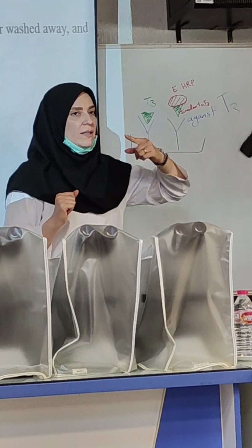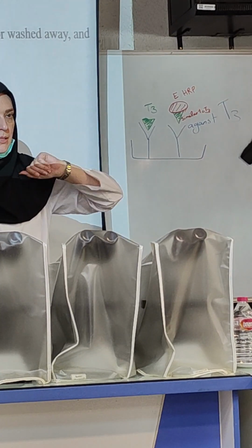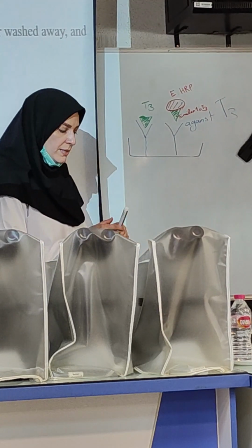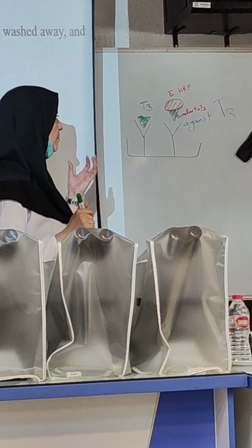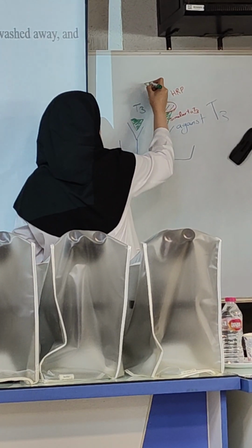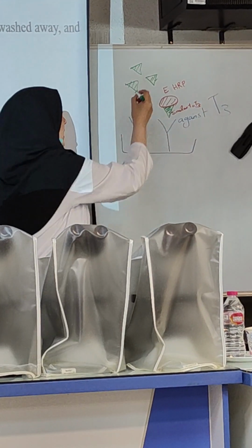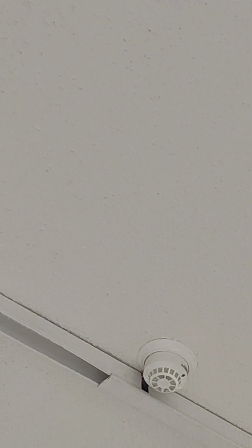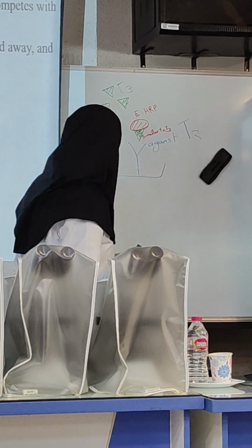Please tell me, in the case of hyperthyroidism, it means that you have a high concentration. This is very, very important, because maybe I will ask you some conceptual questions, so you should understand the concept of the competitive fight. In the case of hyperthyroidism, this is a serum of the patient, it contains a large amount of T3. Who will win between tracer and T3? Who will win to bind? T3.